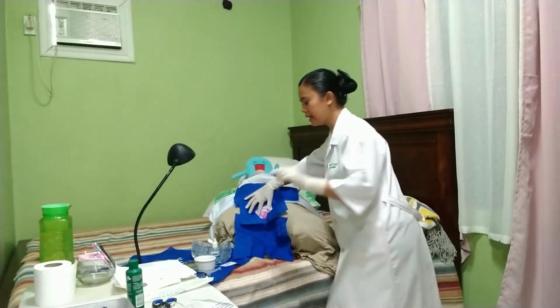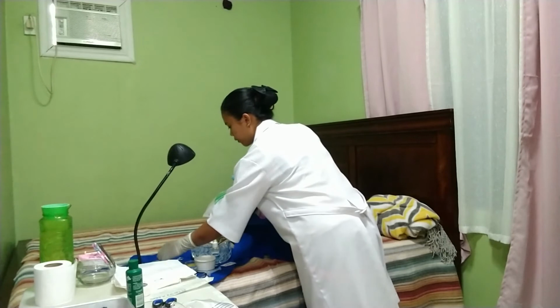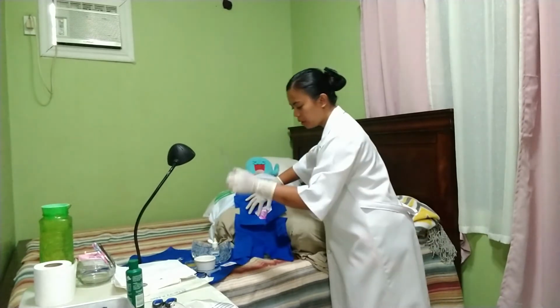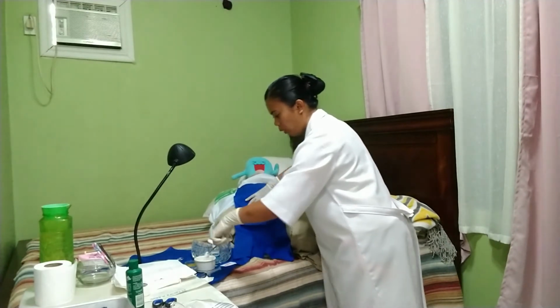use your dominant hand to maneuver around your sterile field. Pick up a cotton ball with iodine povidone.